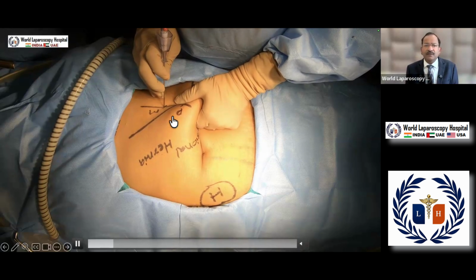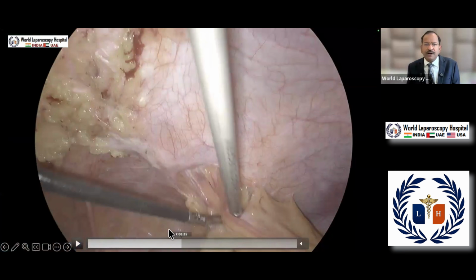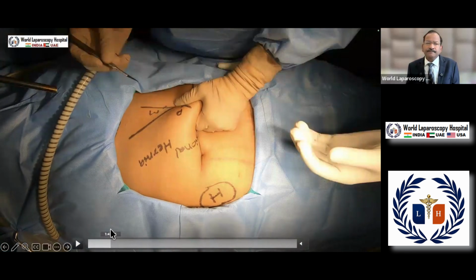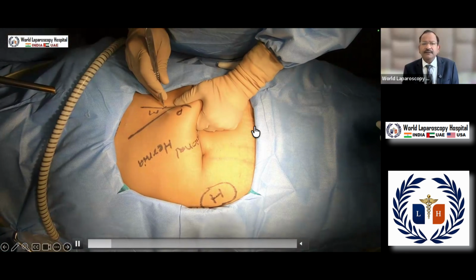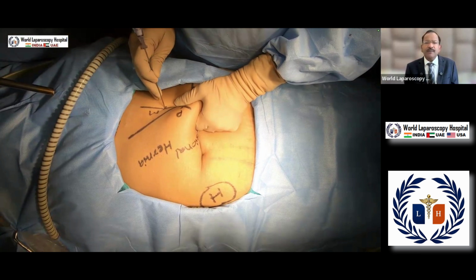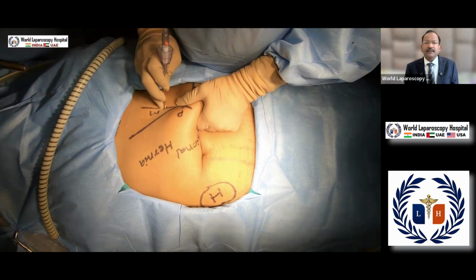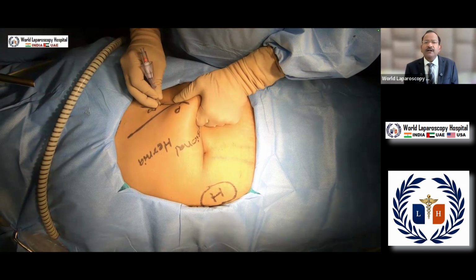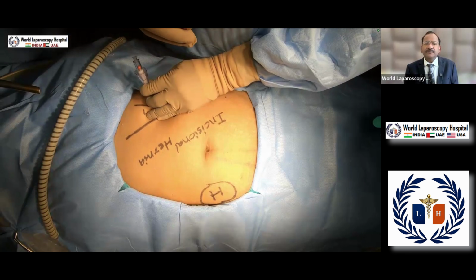This is the first click, and this first click is due to the aponeurosis of the external oblique. So, again I will take it. You will give a stab wound, stretch the Palmer point, and then take the Veress needle, point it towards the stomach, and this is the first click due to the aponeurosis of the external oblique. Then the second click, aponeurosis of the internal oblique, and the third is the peritoneum. So, here you will get 3 clicks. After that, leave it, take a syringe and do irrigation.